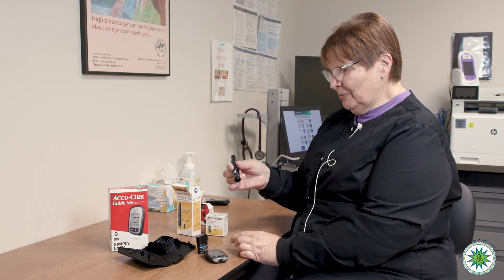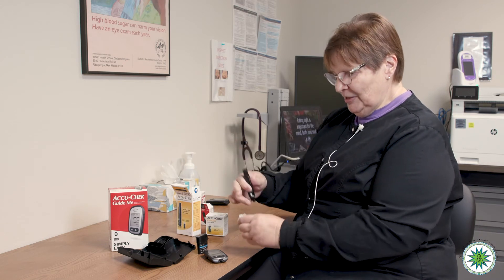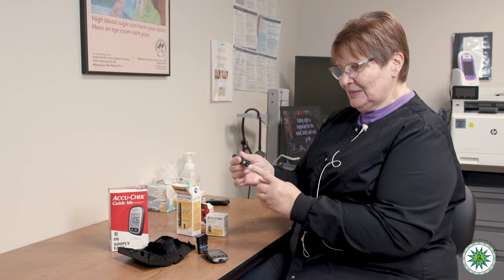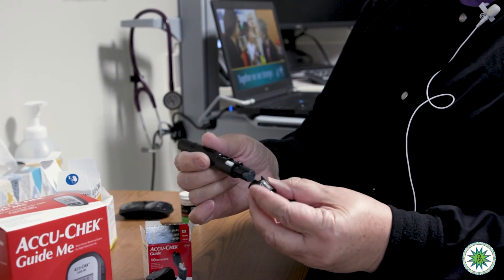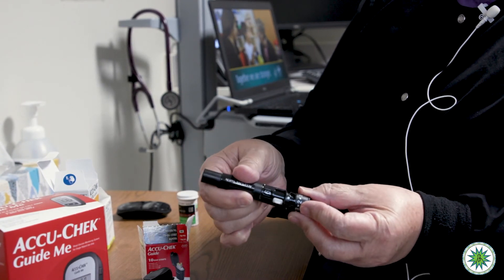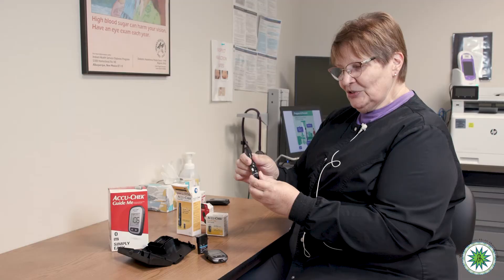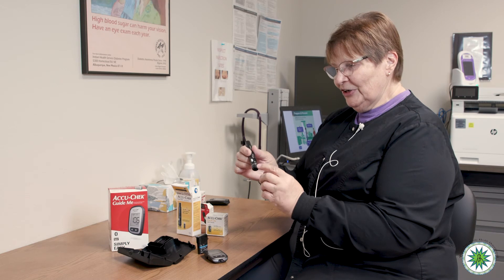To load the drum into the device, you pop the cap off, put the white end of the lancet drum into the device, and push it in flush. It can't stick you at that point, so you can push it all the way in, line up the notches, and put the cap back on. The numbers on the bottom tell you how deep the lancet is going to puncture into your finger.